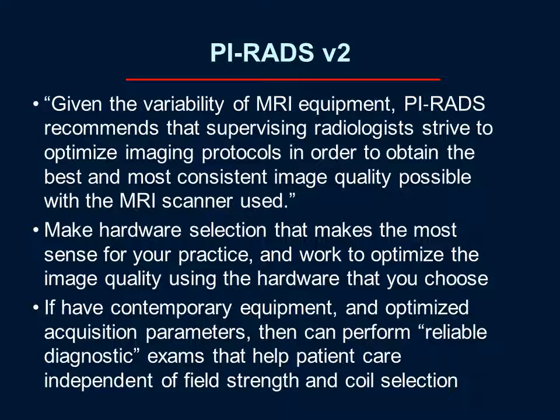In other words, while certainly the hardware selection is important, there's also a large role for how the sequences are adjusted and optimized, and really doing the best we can with whatever equipment we choose to use. If we have contemporary equipment and optimized acquisition parameters, then we can perform, quote, reliable diagnostic exams that can help patient care independent of field strength and coil selection.